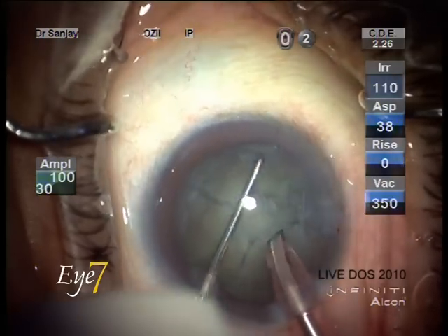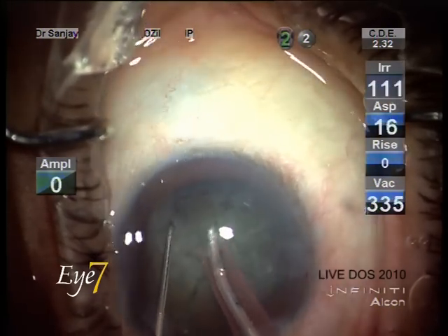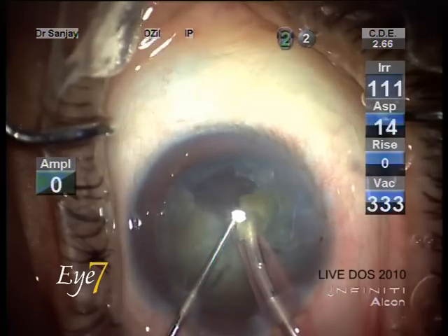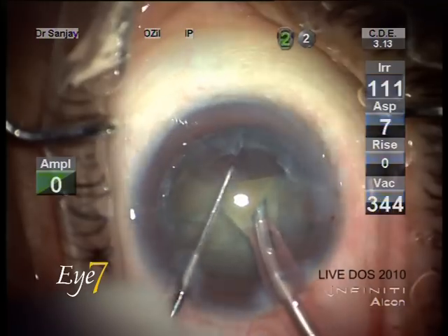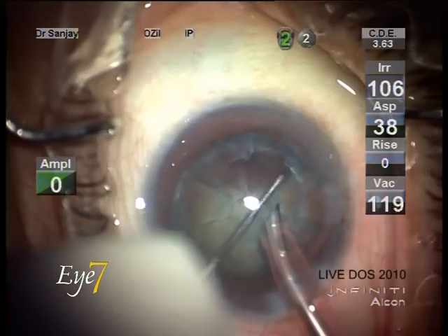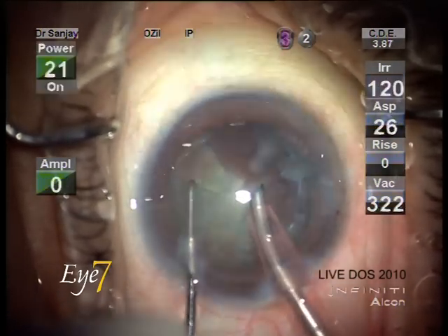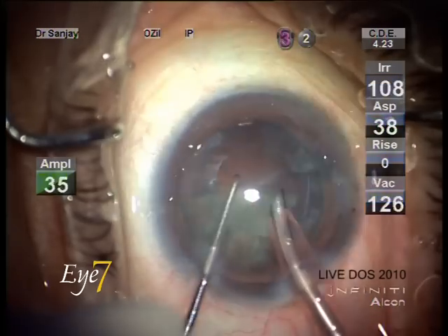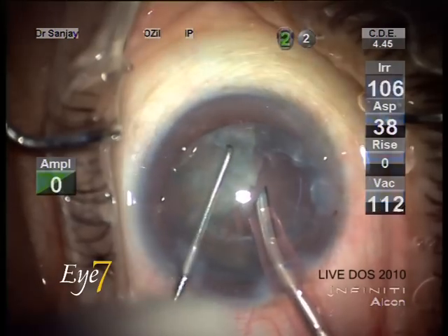We are chopping the nuclear fragment and cutting it up into small pieces in the capsular bag, then picking up each piece and aspirating it. On the left hand part of the screen, the moment the vacuum reaches a certain level, the IP gets activated — the longitudinal phaco is activated for just a fraction of a second and the nuclear pieces are emulsified.